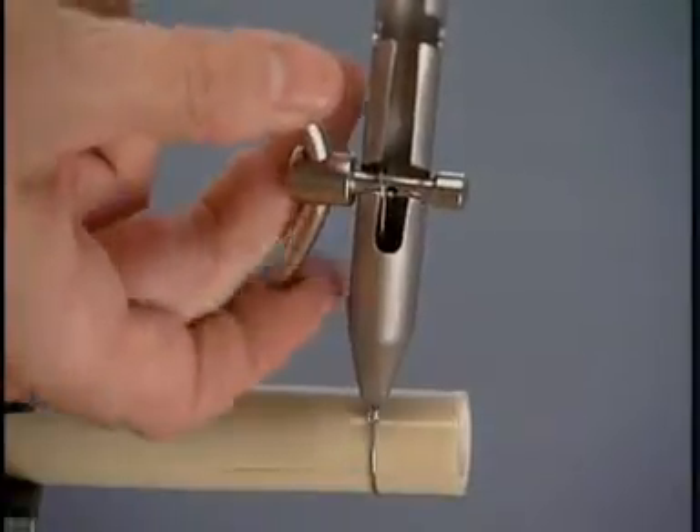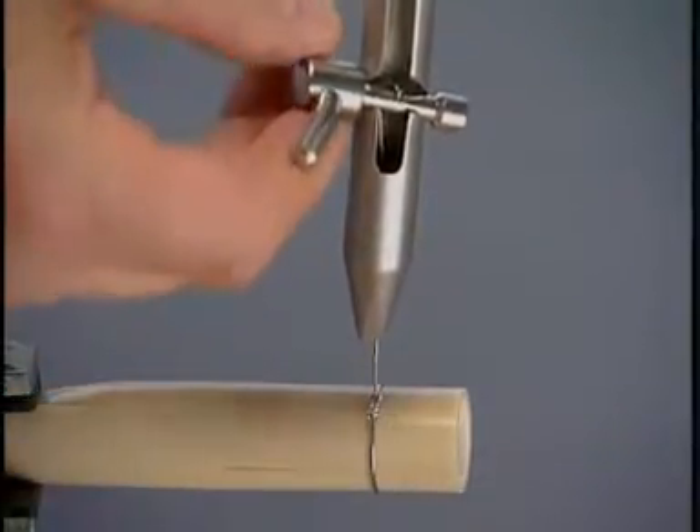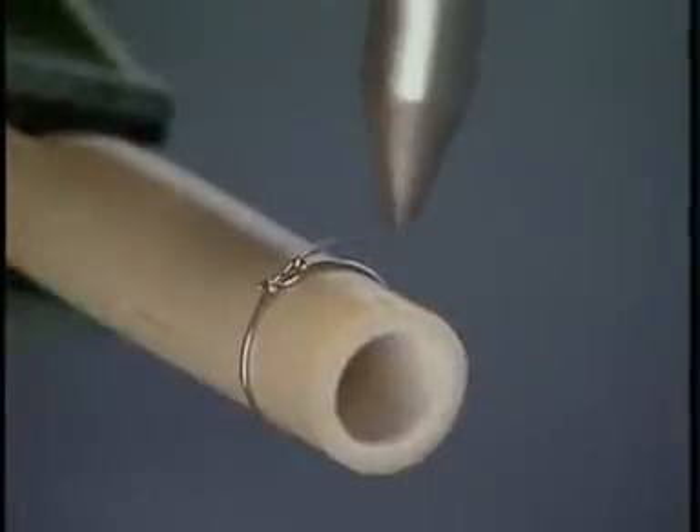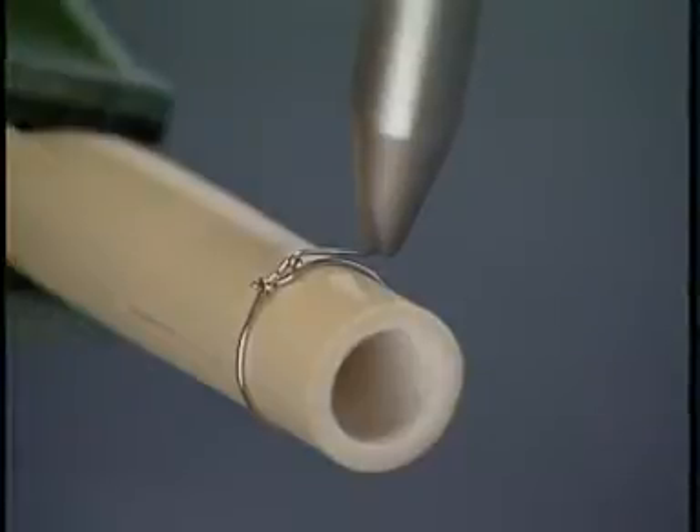To achieve this, the peg is turned in the opposite direction and tension is applied to the instrument to expose approximately one centimeter of wire. The wire is then bent over and cut off with the wire cutter.